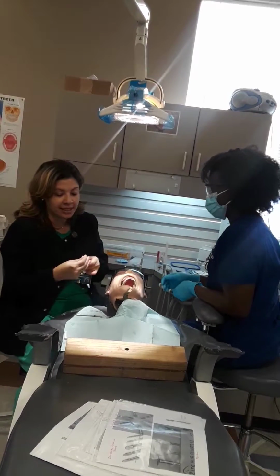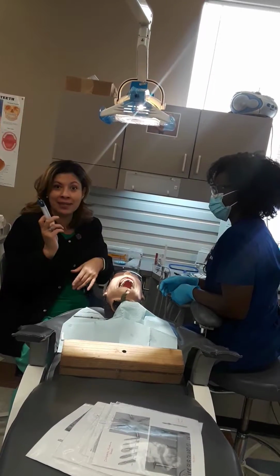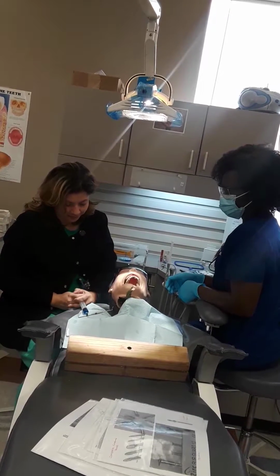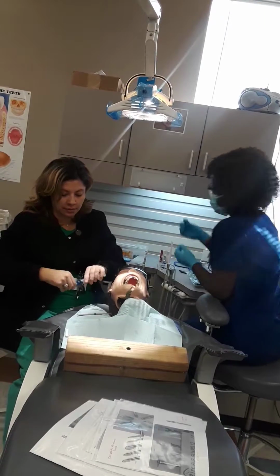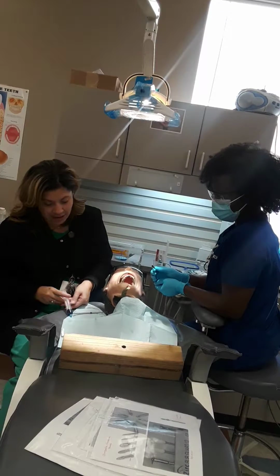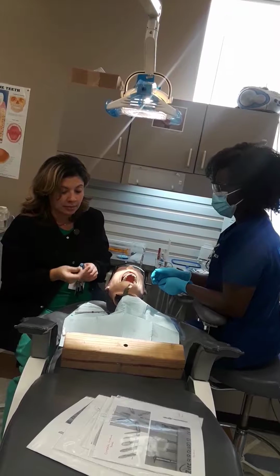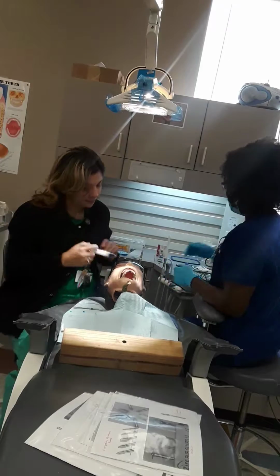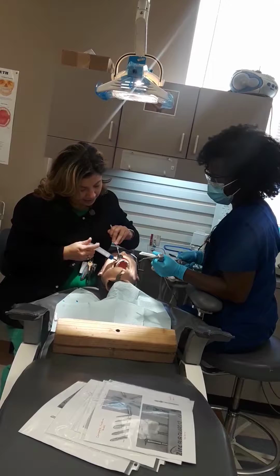Make sure that you can squeeze it. Big tip is to check it before you even sit down, because you don't want to check it when it's time, because now you're wasting time. So you want to make sure that it comes through. This one sucks. Make sure it's just not that, okay? It's not the syringe. There we go. So, it works. Now you can pass it.